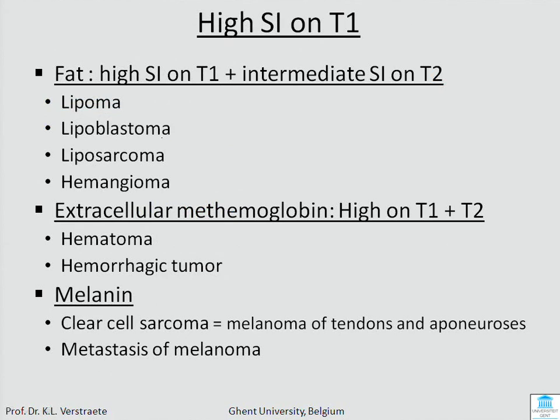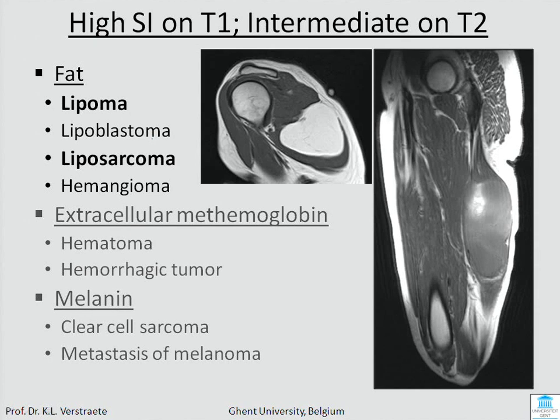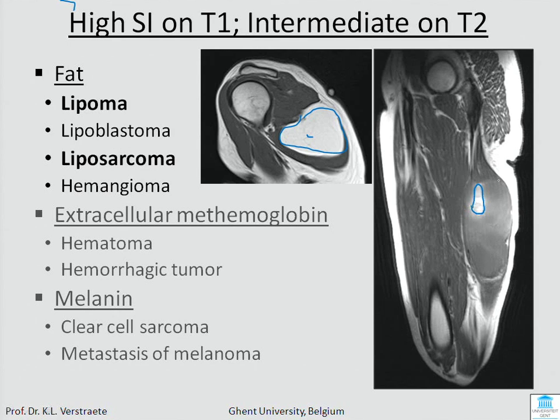Looking at high signal intensity on T1: it can be fat, methemoglobin, or melanin. A homogeneous, sharply delineated fatty lesion with maybe a little fibrous strand is easy — it's an intramuscular lipoma. But you also have the malignant counterpart where there is only a little fat and a lot of malignant fatty tissue that loses the bright T1 signal. A mass with focal high signal intensity on T1 is probably a liposarcoma.